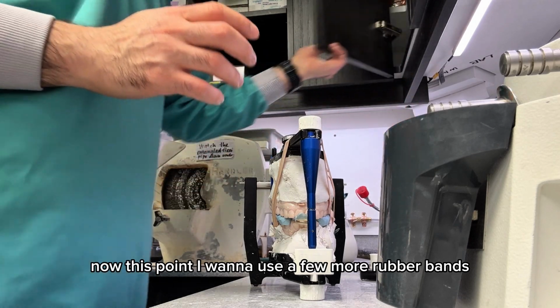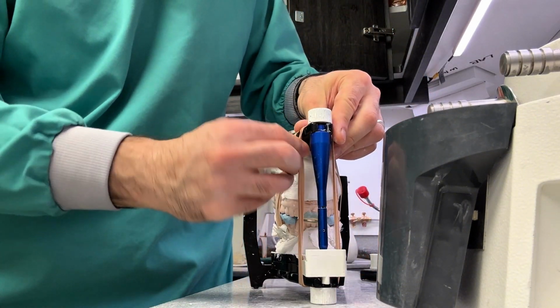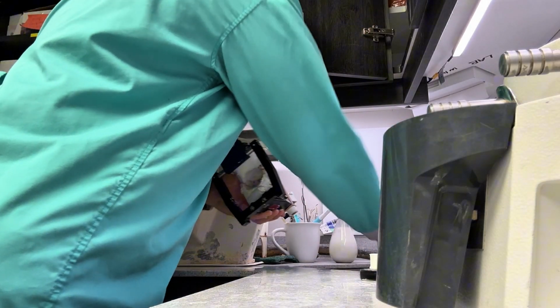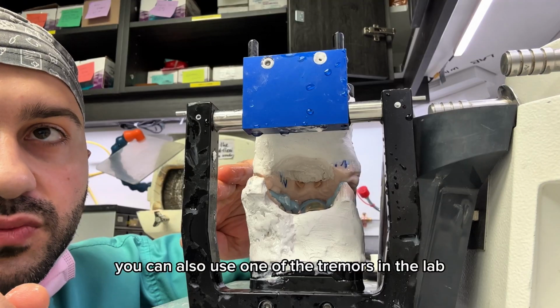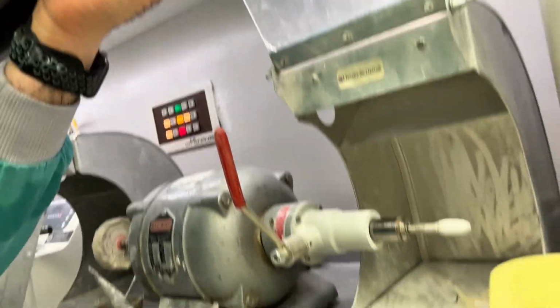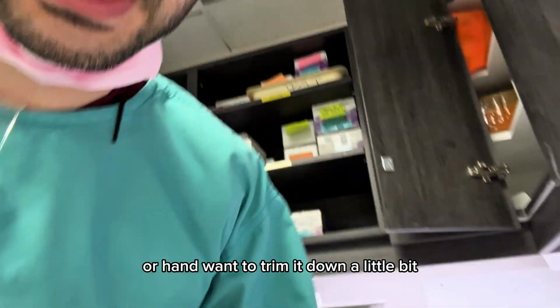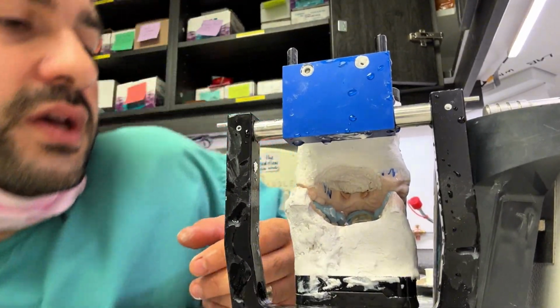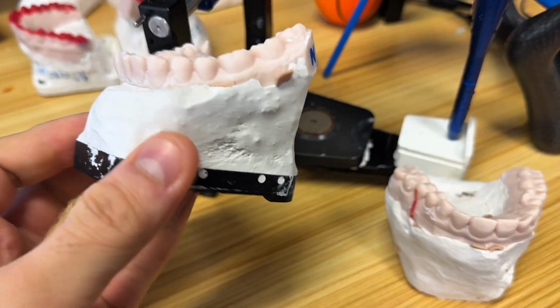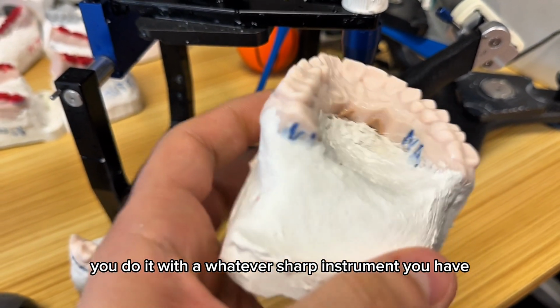Now at this point, I want to use a few more rubber bands. I don't need any extra movement. You can also use one of the trimmers in the lab equipment, like this one. Or a hand one to trim it down a little bit. That's probably something I will do. It's important to wear the lab coat, so in case you need to see the patient, you can remove it. After your stone completely sets, you do clean it up. Do it with a lab knife. You do it with whatever sharp instrument you have.